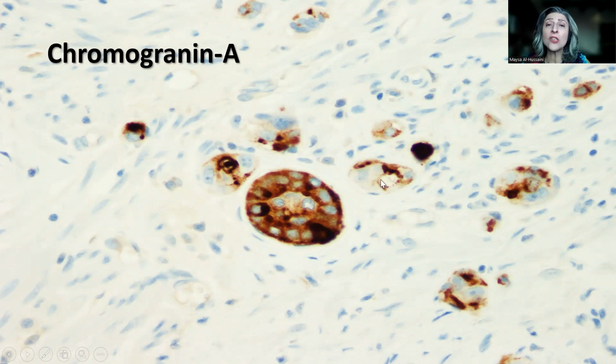And frequently actually with chromogranin, I always tell my residents that you have to go on high power magnification before saying whether chromogranin is positive or negative, because quite often it's actually like this one here, just a small intracytoplasmic dot positivity with the chromogranin. But in this tumor, it was a crisp positive staining.